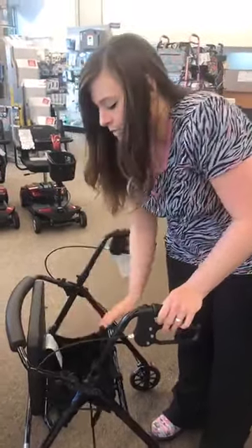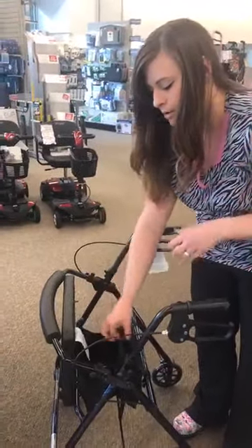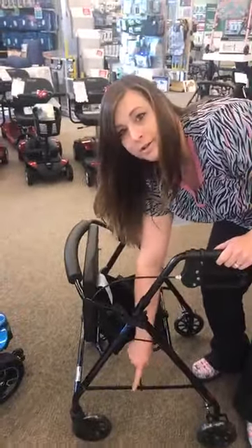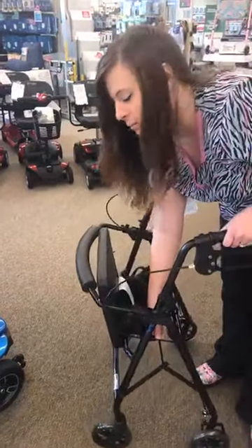Now, if you don't have this strap, again, there's different types of straps on it. This one just happens to come across the whole thing. If you're missing your strap, that's okay. You can just pull up on the bar itself. Just watch your fingers right here so you don't get them pinched in there. But you just pull up on that bar and it's going to fold exactly the same way.